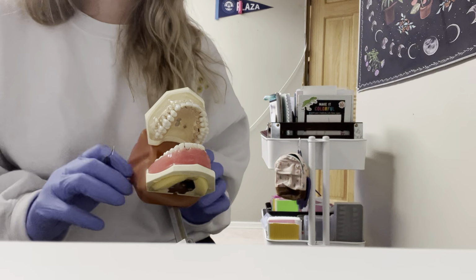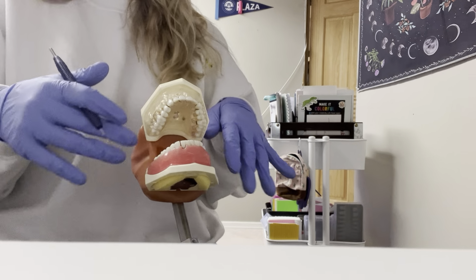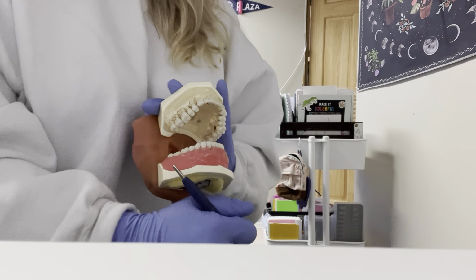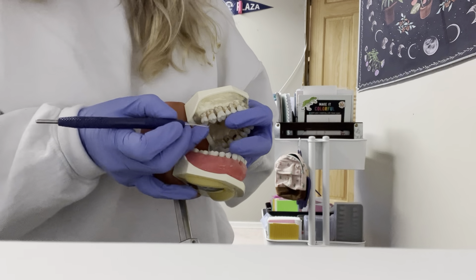When you're probing, you don't necessarily have to sit at any sort of clock position. It's whatever you're most comfortable with. Just so you can see the best, I'm going to start at tooth number 1.